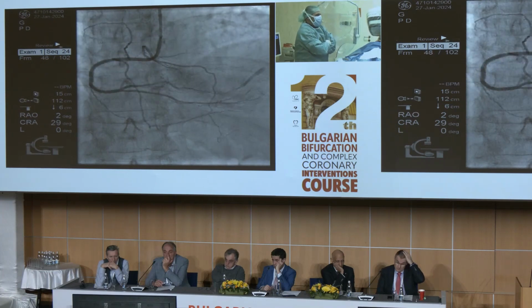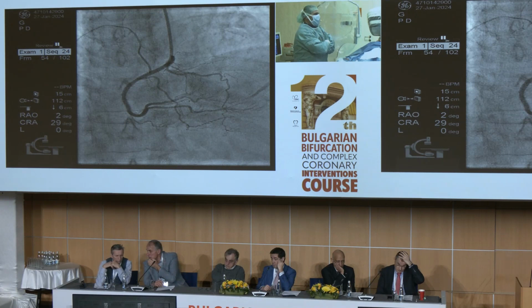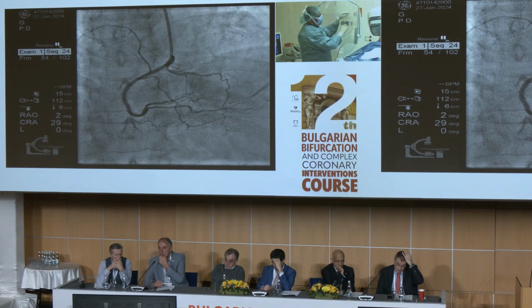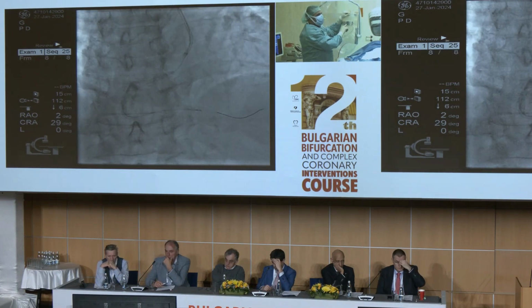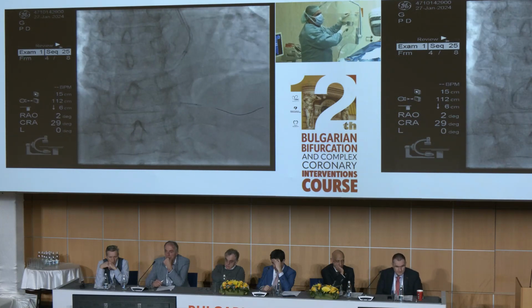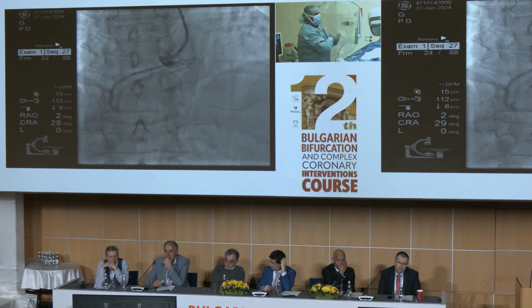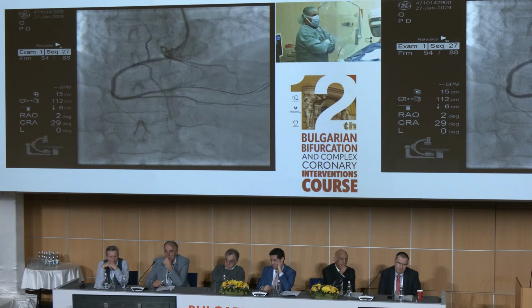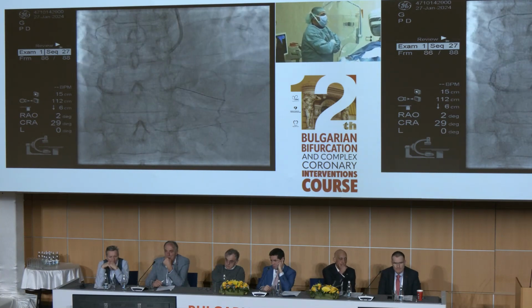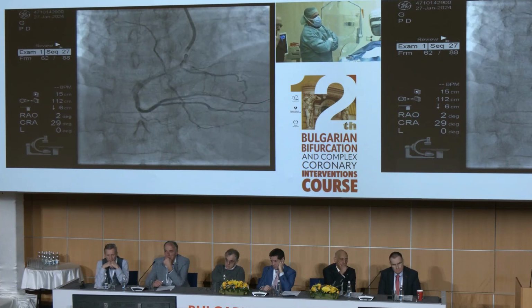Echocardiography was negative. There was nothing in the pericardium, but after an attempt of sealing with a 1.5 balloon for one minute, 2 minutes, there was still staining of the contrast, and we felt more comfortable to end the procedure today.